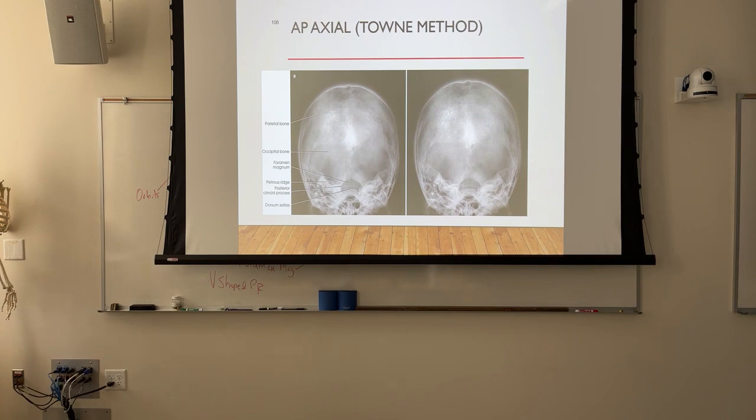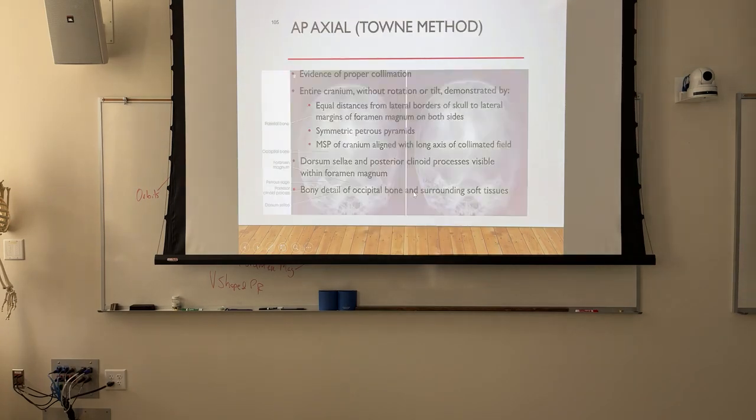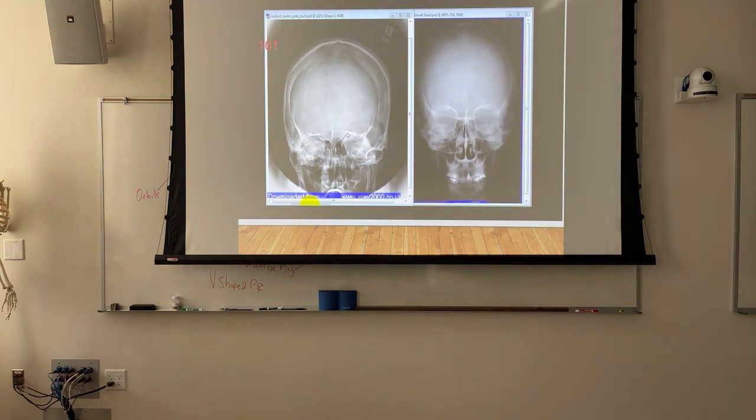And if you're a fan of old horror movies, Alien, it really looks like the alien skull. It's that stretched out in appearance. So you might have a tendency to say, wait a minute, I can't see the orbits in that, and I also can't see the orbits very well in that. Yeah, but do you see the foramen magnum in this?